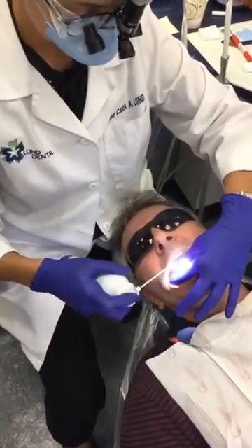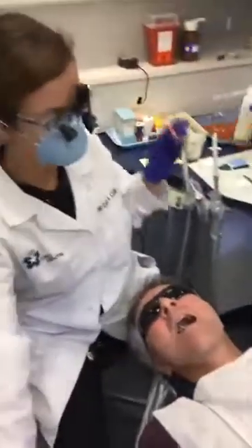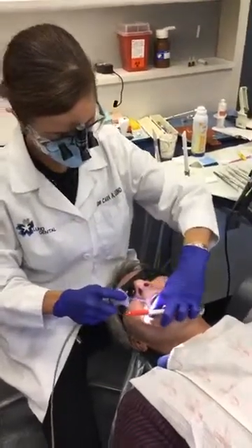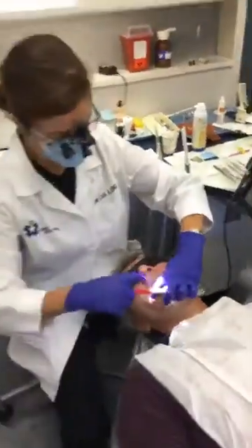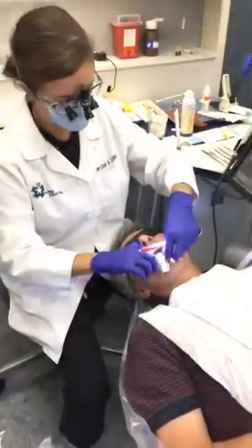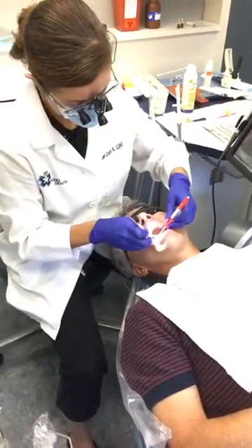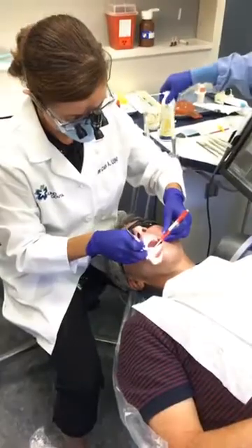Very cool. It just gives the image something to help it pick up the image faster. We air dry it and then we just have to make sure we can really see the crisp edge of our tooth — that we call the margin. Make sure everything looks perfect.